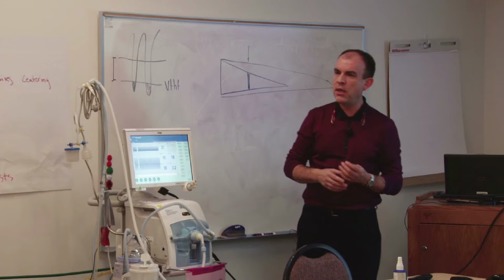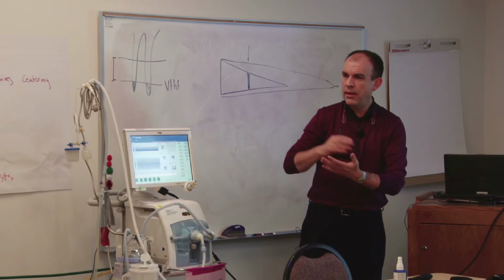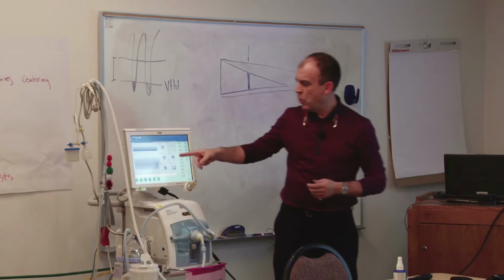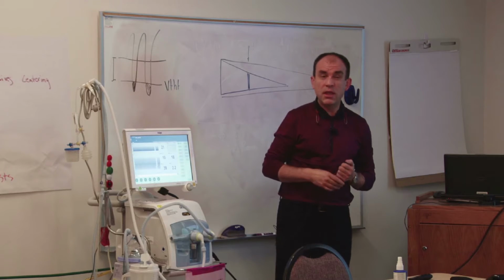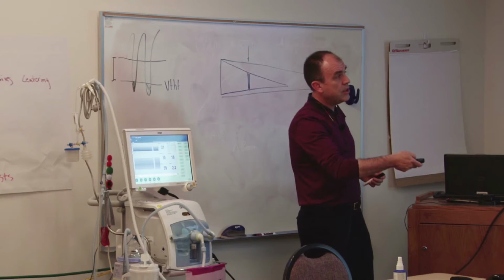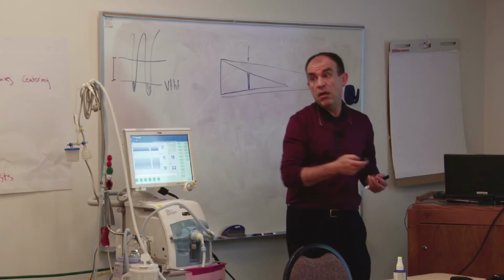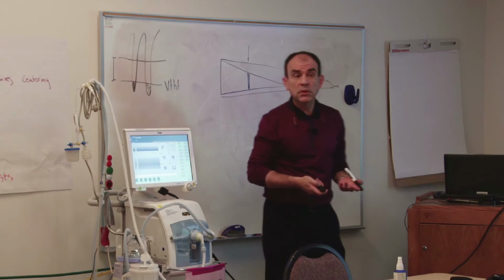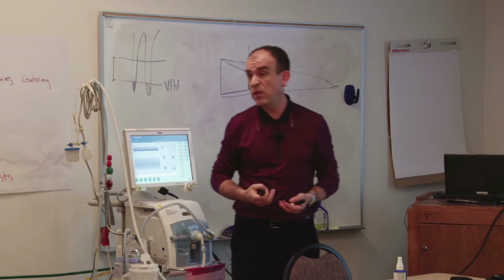The problem would be if the mother is cuddling the baby, and that could attenuate the vibration. So the ventilator could get to a point, if it's in volume guarantee, where increasing the amplitude just doesn't do it, and it will probably alarm, saying I'm not reaching the desired VTHF.